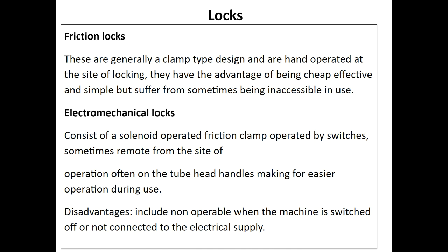are great because you don't have to constantly unscrew and rescrew something in, right? The only friction lock I think that's left on the portable is the little screw to turn to move the collimator box, which is still technically a friction lock, right? But the older portables, at least the older GE portables, actually didn't swing in both directions. So you had to figure out which way you were going into the room, where they were going to be. And then sometimes you'd have to spin your tube outside of the room so that when you got into the room, it would turn in the correct direction. Now it just goes whichever way you want it to go. You would think it always did that, but believe it or not, no. There's always improvements to be made, and you don't even realize them until they happen.